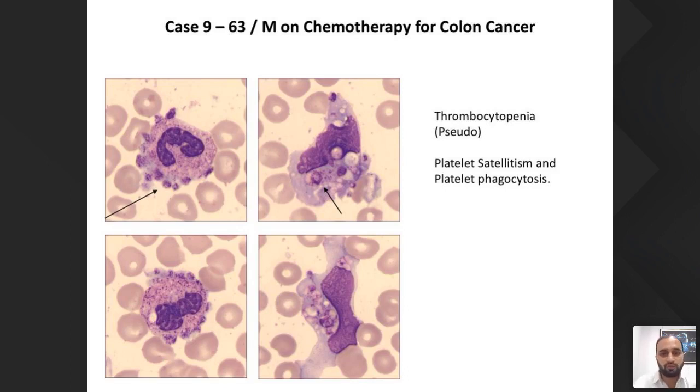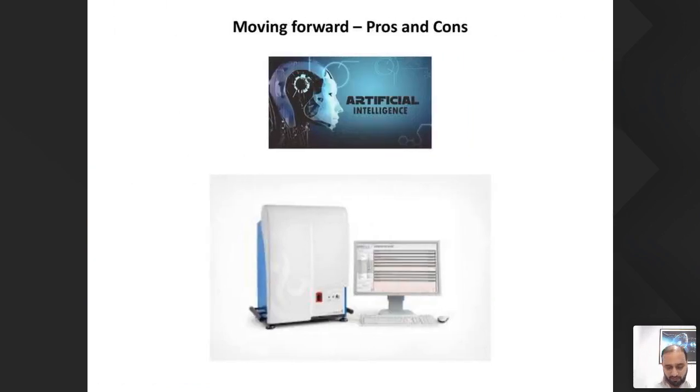And this was not a thrombocytopenia, rather a pseudothrombocytopenia. I immediately asked for a citrate sample. The platelet count came out to be more than 1 lakh and it was reported so. Well, that would be all with my cases.